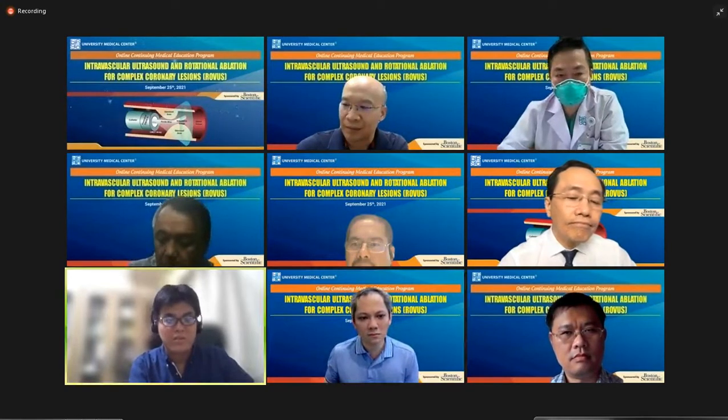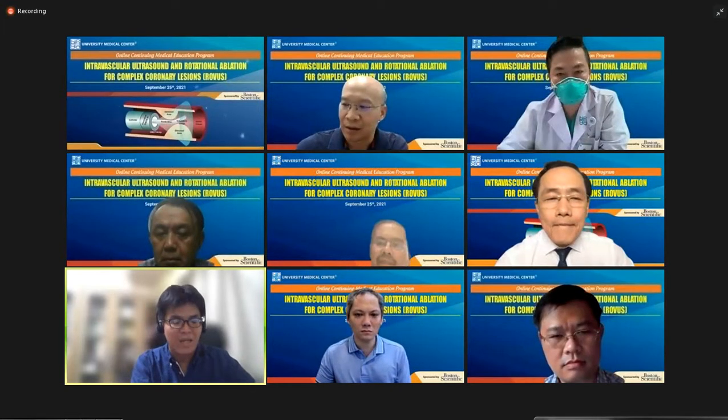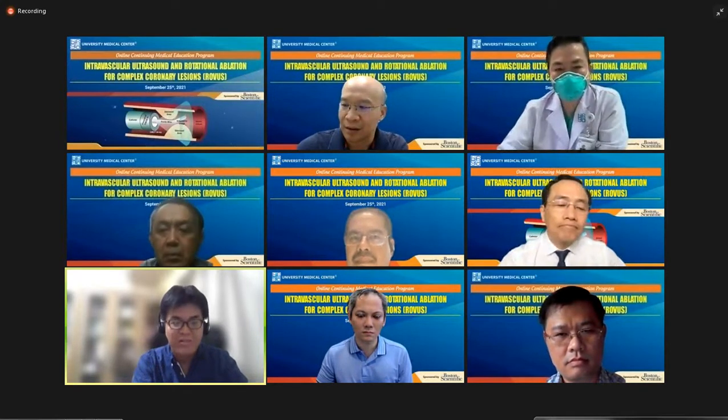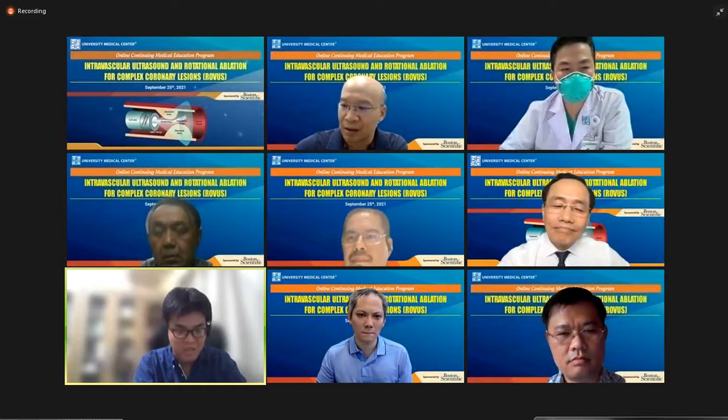Thank you for your question. Actually, before the procedure I measured the FFR for the diagonal branch. As a result, the FFR is negative, so we treated only the main branch lesion.